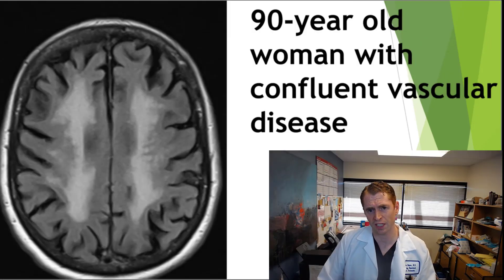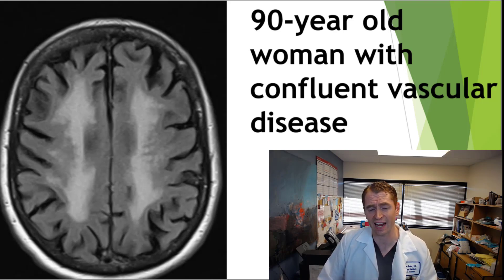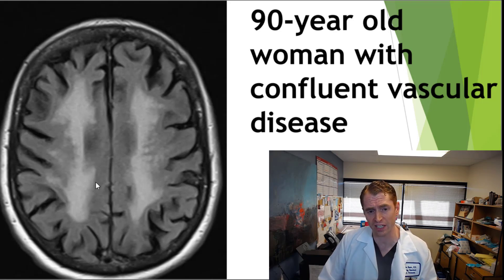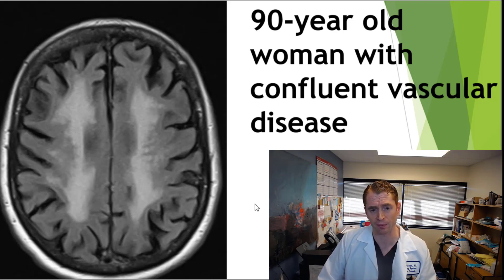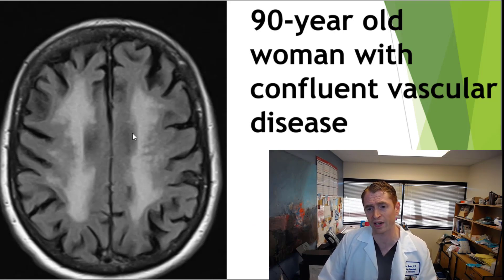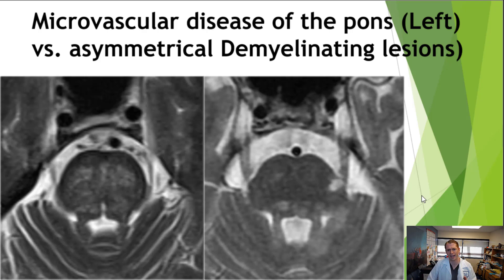In cases where the lesions are more advanced, it can be quite difficult to discriminate between demyelinating disease and vascular disease. This is a 90-year-old woman with extensive white matter lesions, but you can see it primarily involves the subcortical white matter and doesn't involve the periventricular areas as much. The juxtacortical areas are somewhat spared. Sometimes looking closely at the brainstem can be helpful — here we're looking at axial slices at the level of the pons.